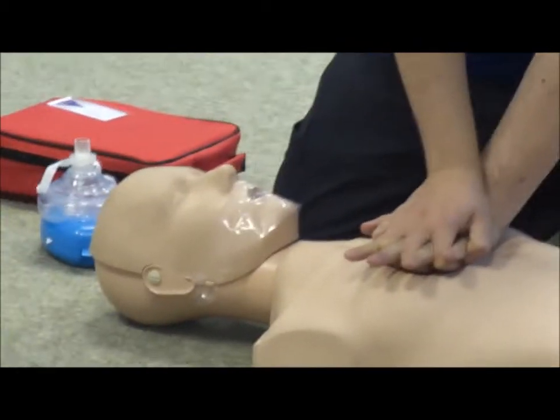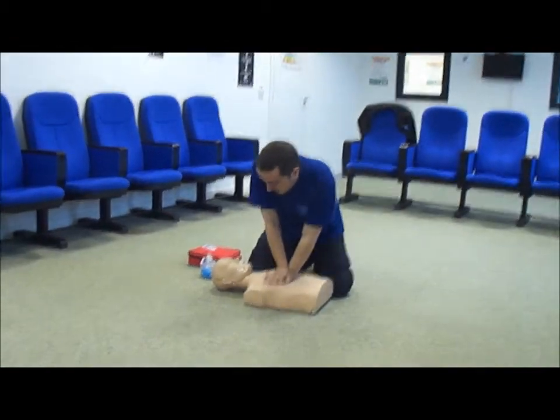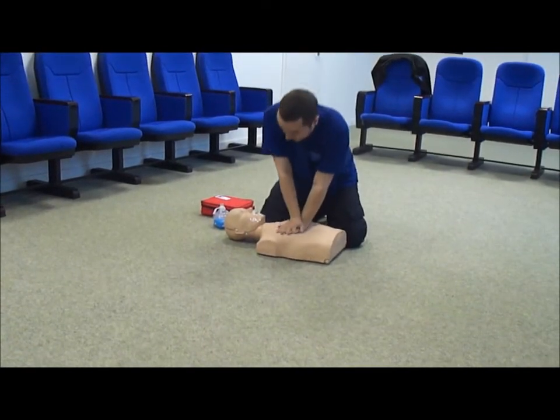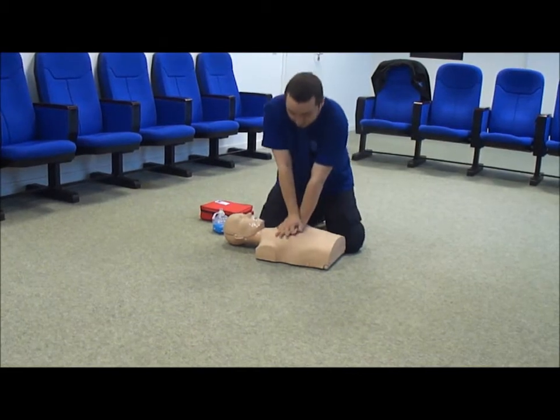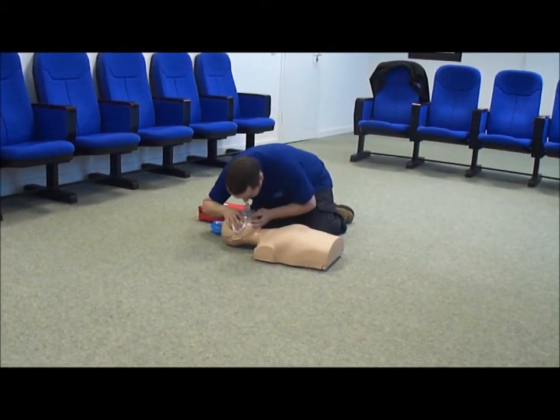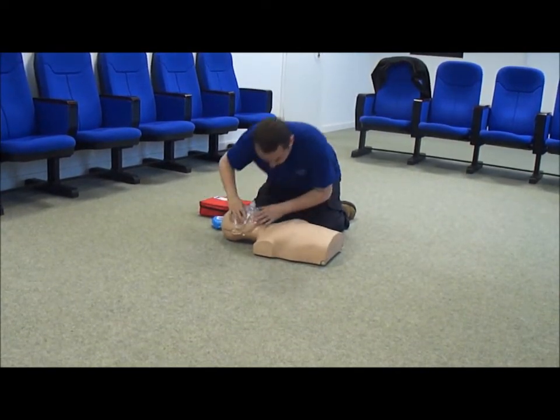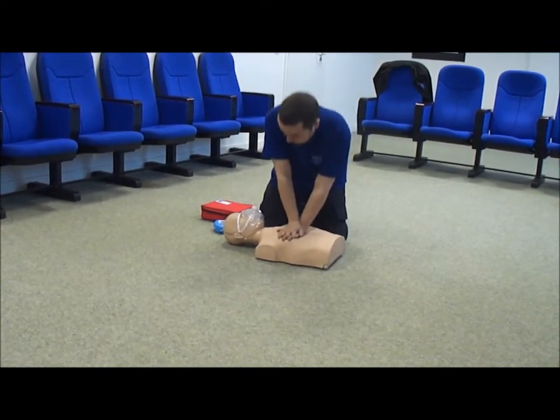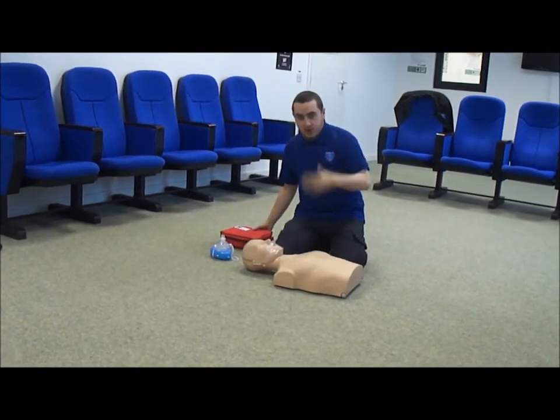1, 2, 3, 4, 5... 28, 29, 30. Back to my rescue breaths. Okay, and I keep going between chest compressions and rescue breaths. And then when the AED arrives, we immediately stop chest compressions.